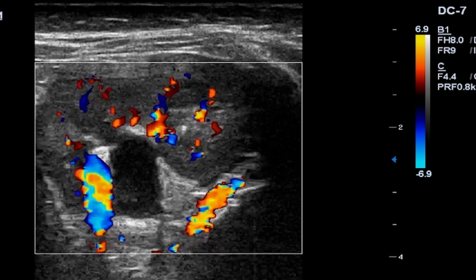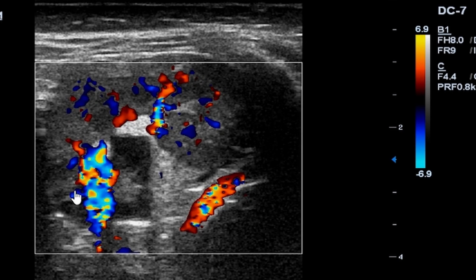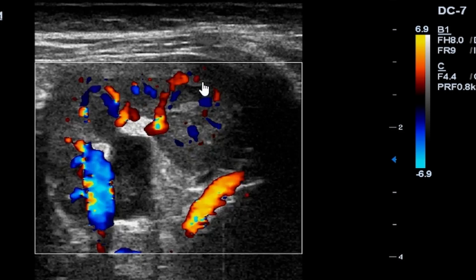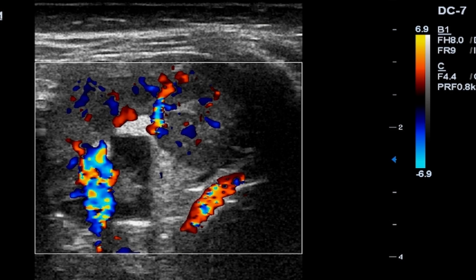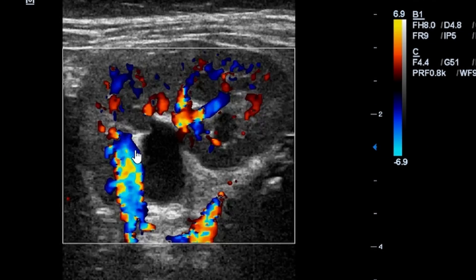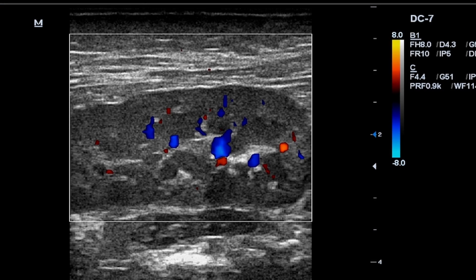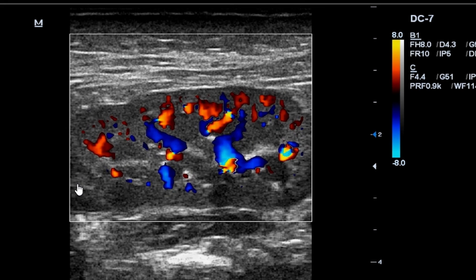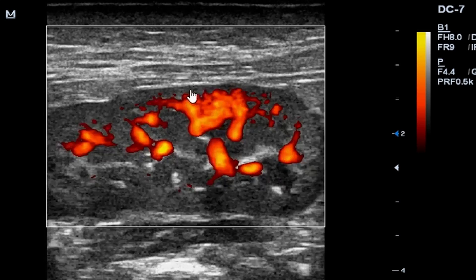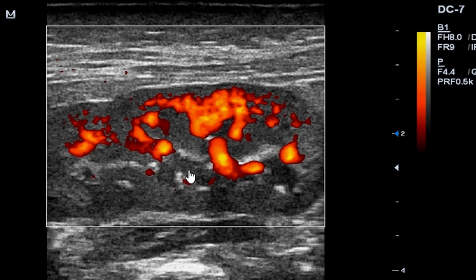This is suggestive of an inflammatory process. On color Doppler, you can see the exaggerated flow that is characteristic of pyelonephritis or an inflammatory process. You can see our right kidney with the chaotic flow taking place — this is consistent with hyperemia, which is one of the signs of an inflammatory process. Besides swelling, we also see the hyperperfusion presenting. On power Doppler you can again see the chaotic flow, consistent with pyelonephritis.